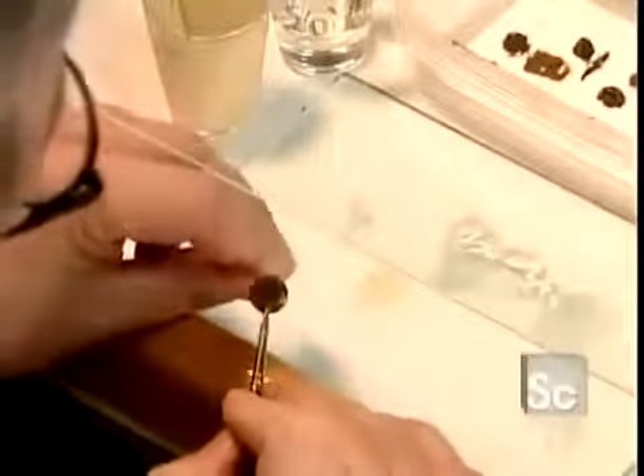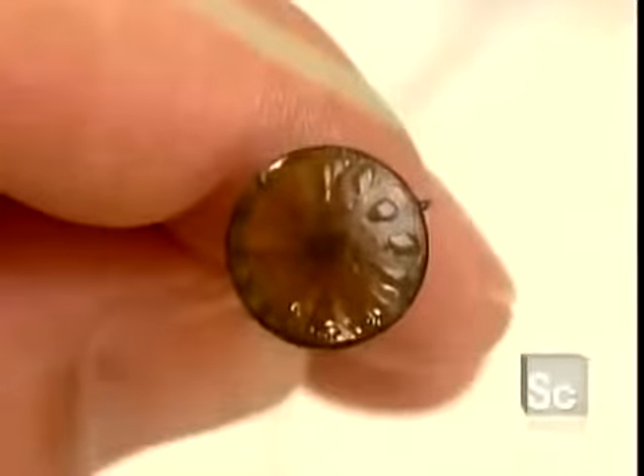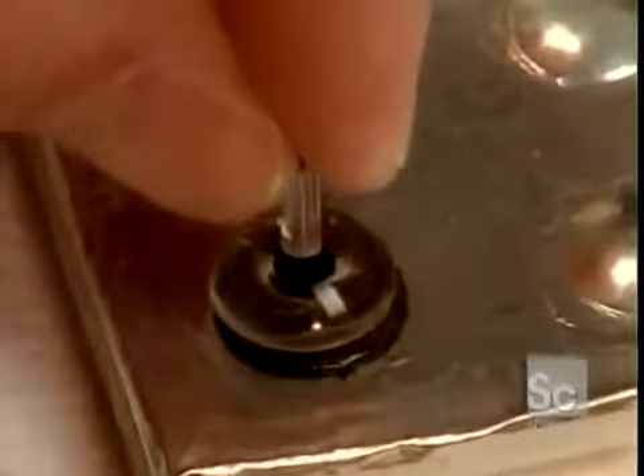They take a curved black acrylic disc and paint it as realistically as possible with high-quality artist oils. The patient has to be present so they can match the real eye. Next, they glue an acrylic cornea with an appropriately sized pupil onto the painted iris.